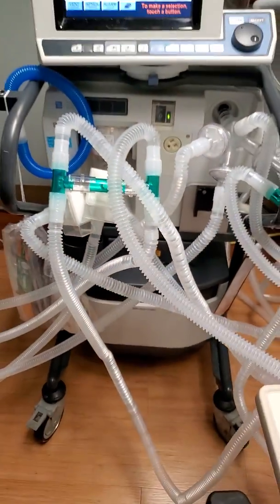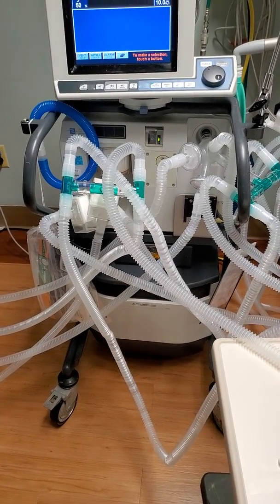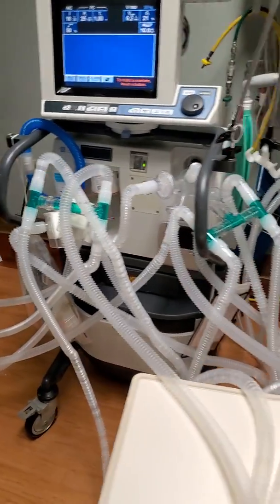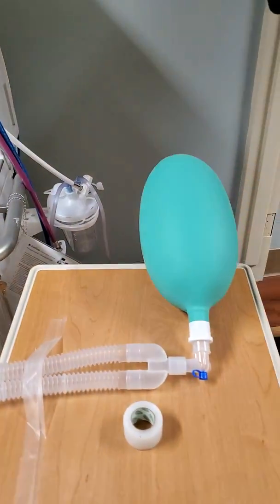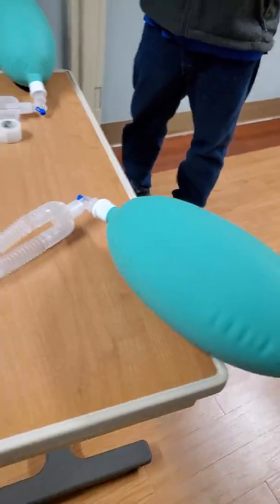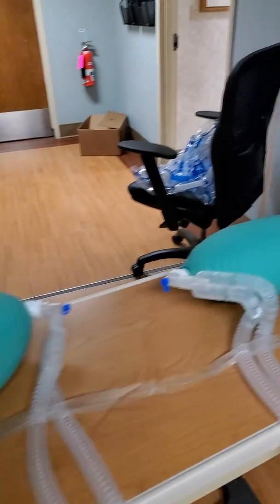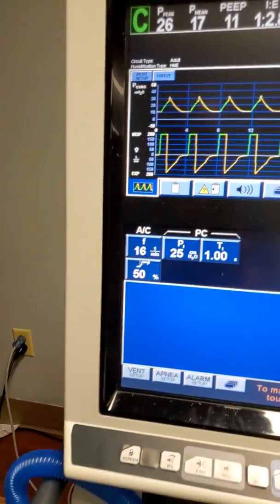So when you step back, you see all of these different tubes, which are truly confusing, but there's a method to this madness. And that method is allowing us to currently ventilate 1, 2, 3, 4, 5, 6 and 7 patients, and we could potentially get another one and more if we needed to. And here's the way to do this.